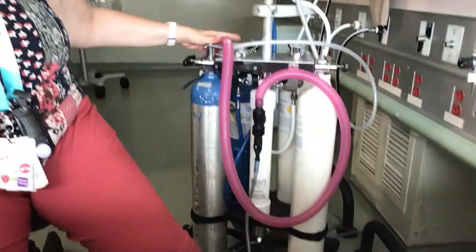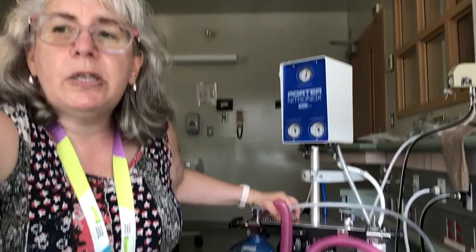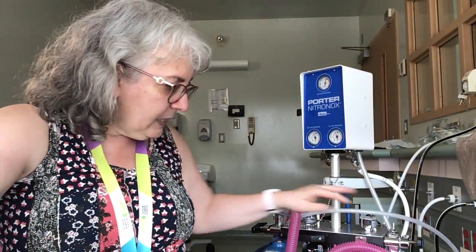So this unit is completely portable and can move around, and it can go to triage, and it can be used successfully in triage. The most important piece is around the scavenging system. I'm going to go through that in a minute, that it's hooked up to the suction container.